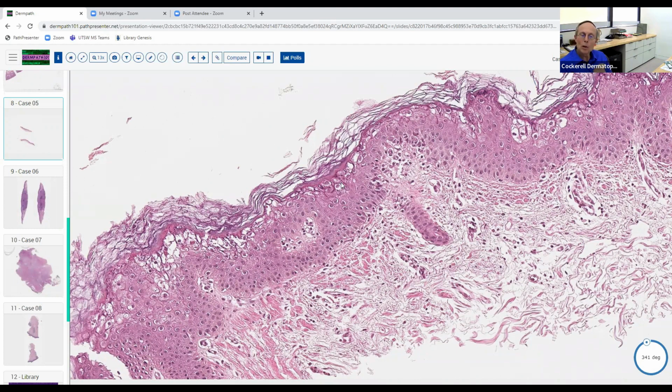Well, they can occur as multiple small keratoses, disseminated epidermolytic acanthomas. So patients come in, and it looks like they have a lot of little verrucous papules, warts, or whatever. You biopsy it, and that shows this. It's been described in rare cases of Grover's disease, this pattern. It can also be seen as a paraneoplastic process. Patients that have so-called Unna-Thost palmoplantar keratoderma, sometimes you biopsy that and it shows this pattern.